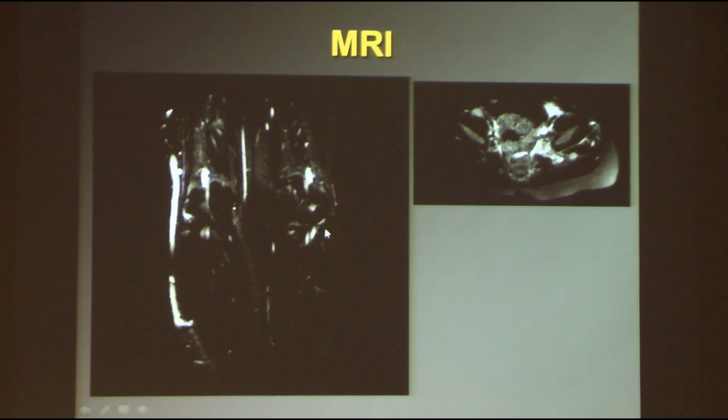You see in the normal leg, the uninvolved leg, the superficial veins are really pretty small. At the level of the pelvis here, you see, not too well, but you see femoral vein is present on the right. On the left here, you see quite a large iliac vein. That's one of the deeper ones.